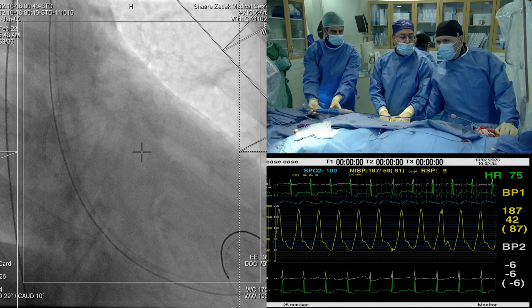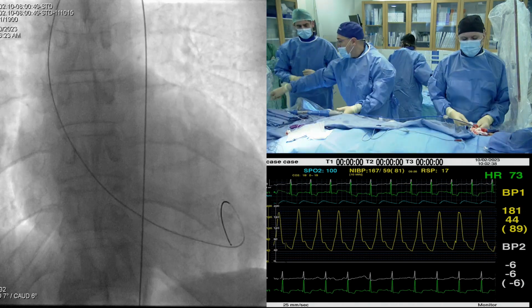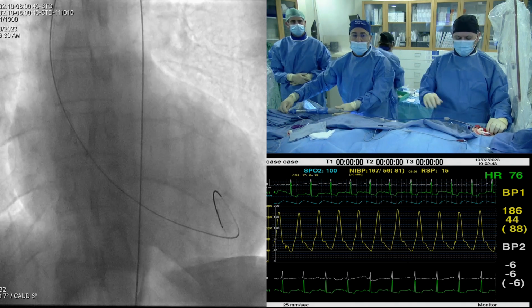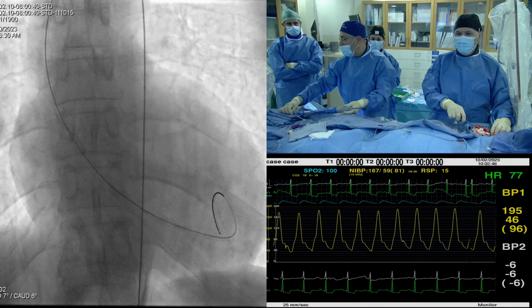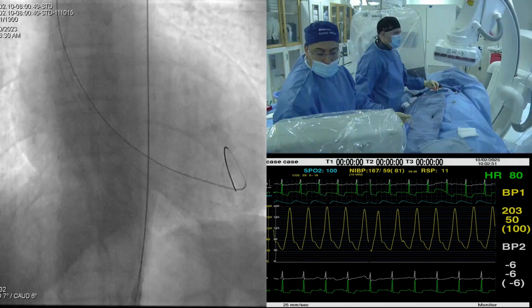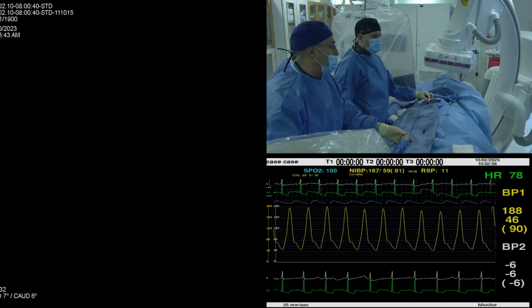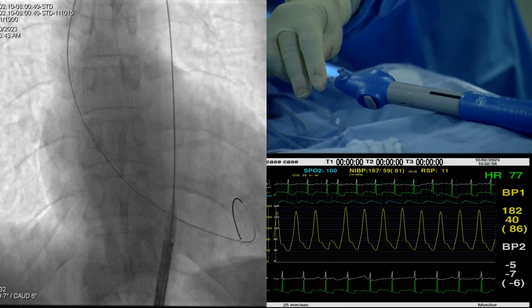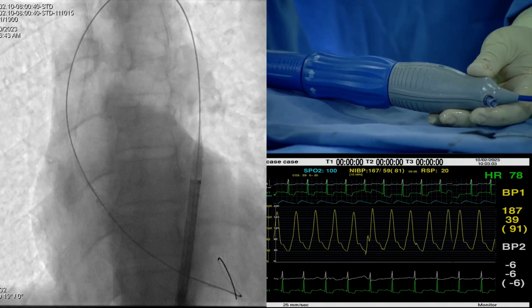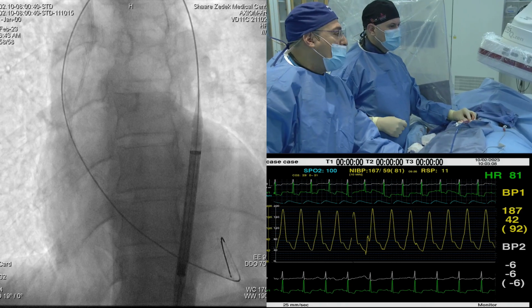I think in certain anatomies, particularly if you have a horizontal aorta and a very calcified anatomy, these heavy wires should be chosen. Otherwise, the risk of ventricular laceration would be there with heavier wires like the Lunderquist. So routinely, we should probably take the Safari or the Confida and keep Lunderquist for difficult anatomies. Yeah, including right and non-coronary cusp fusion and bicuspids, where the trajectory is totally awkward. So in that case, pay particular attention when using it.